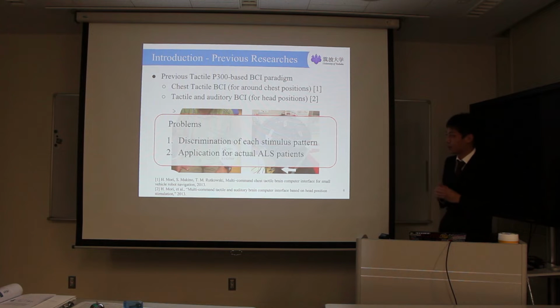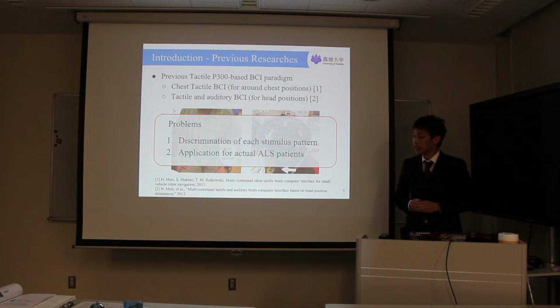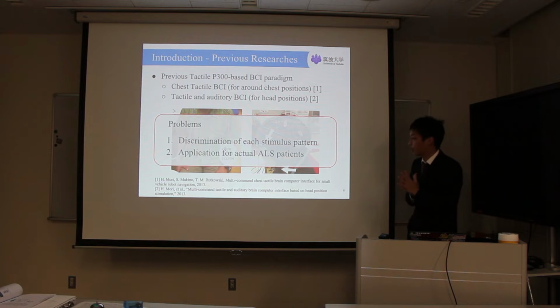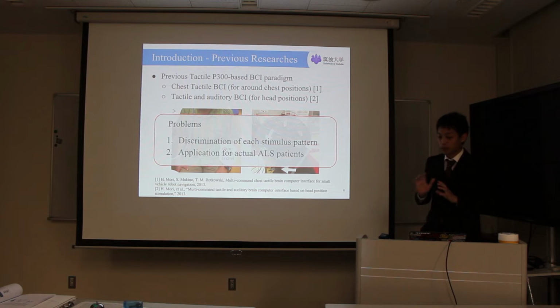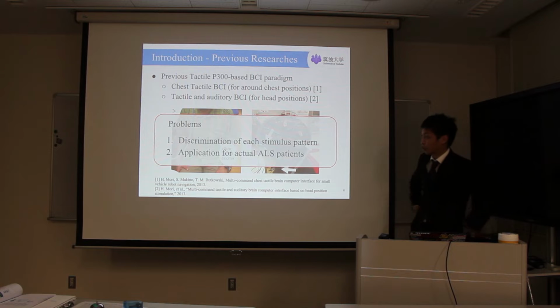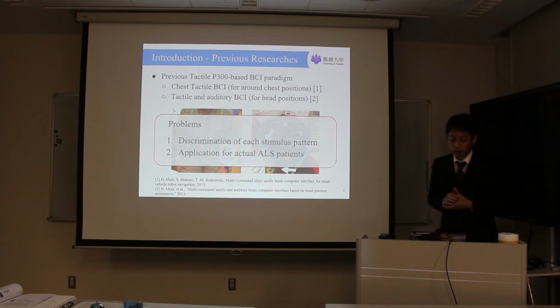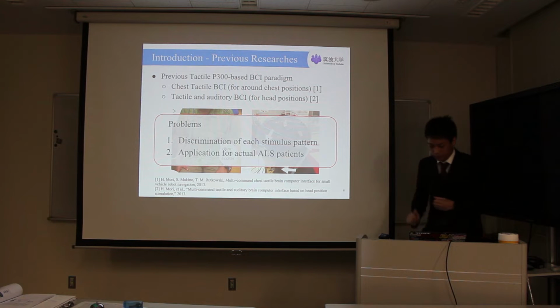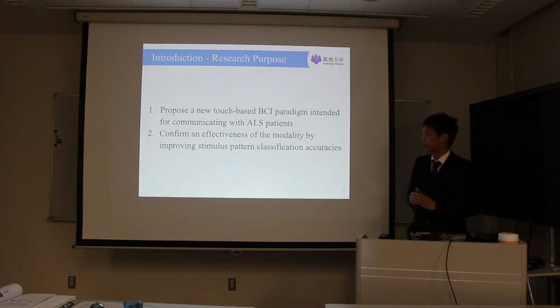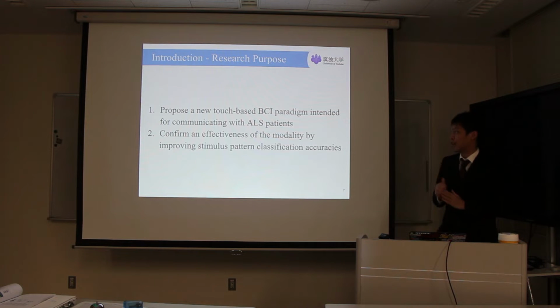Another problem is the application for ALS patients. Sometimes care workers are very hesitant to touch the facial area, or those patients sometimes do not have a sense of touch at all on certain areas of the body. So to solve these problems, in this project we propose a new tactile, touch-based BCI paradigm, especially for communication, applied to ALS patients.